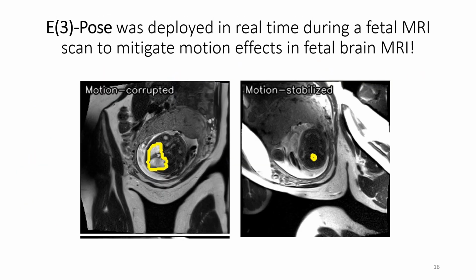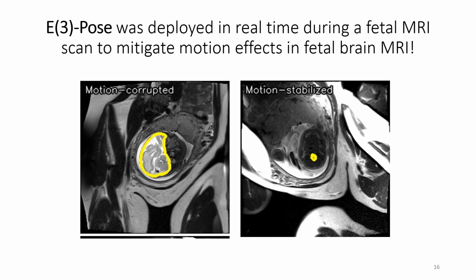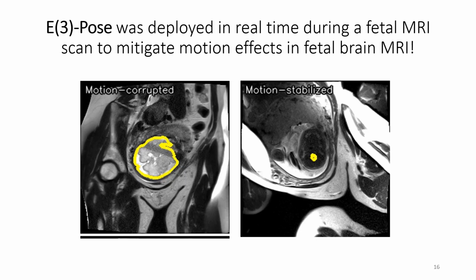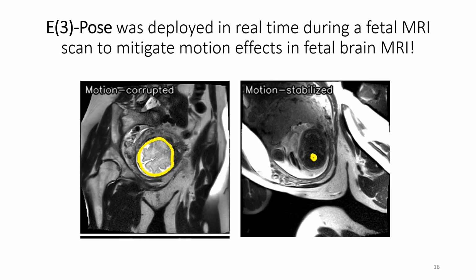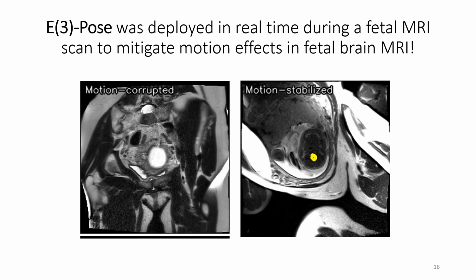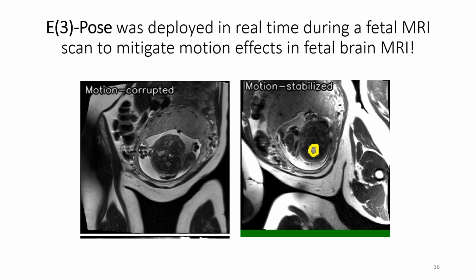So can we use E3 pose to solve an important clinical problem? Yes. We use the estimated fetal head pose from navigators to adaptively adjust the imaging plane of higher quality MRI slices that are acquired for radiological assessment.